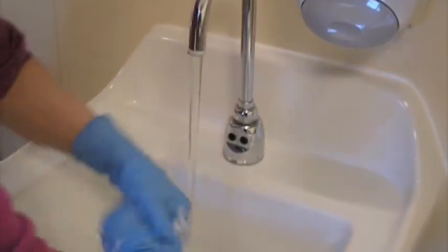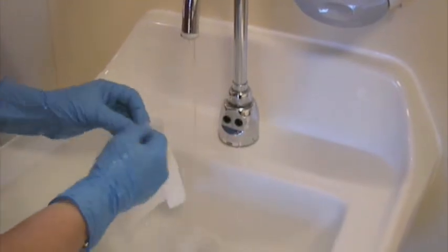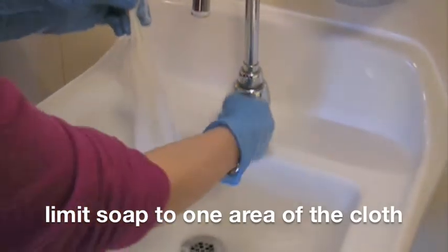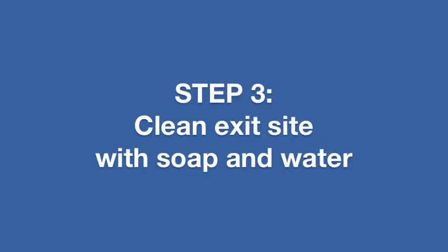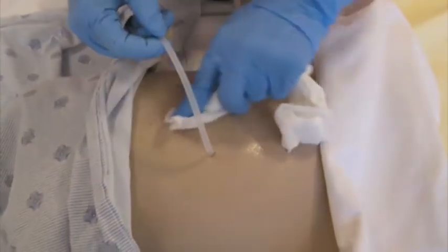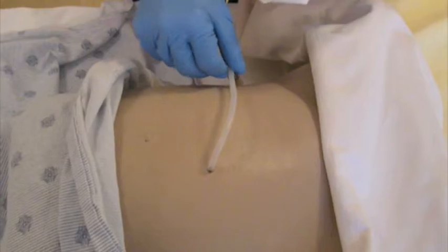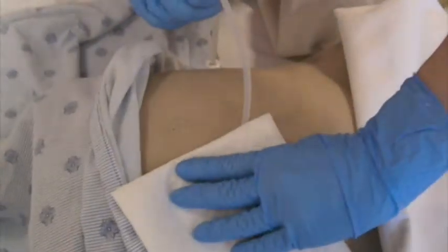Continue with a thorough hand wash. Take your vernicare cloth and soak it with warm water. Apply a small bit of Gojo soap. Wash the exit site and surrounding skin in a circular motion, starting from the exit site and working outwards. Rinse well with the soap-free half of the cloth. Gently pat dry the exit site with the dry vernicare cloth.